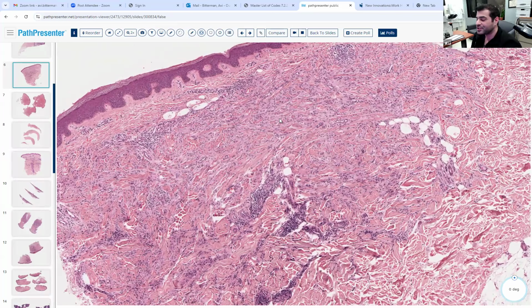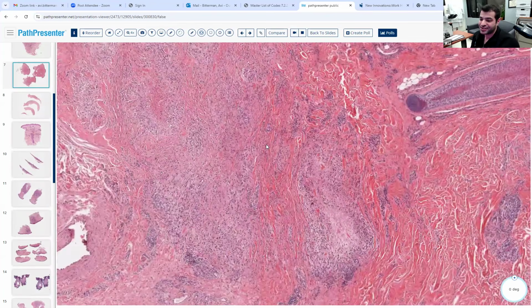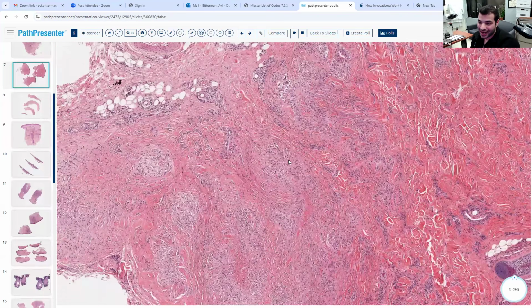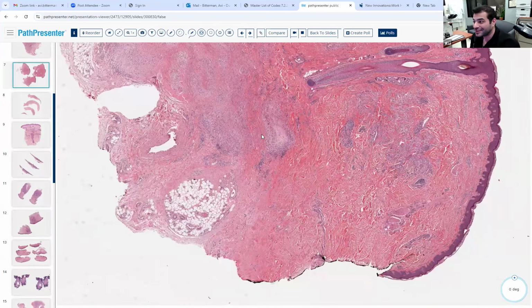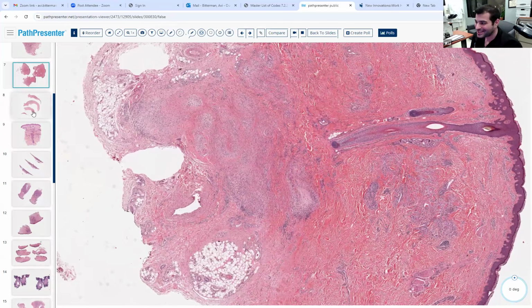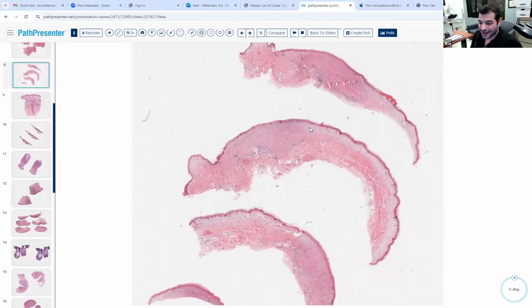Okay. So there's granulomatous infiltrates that are more diffuse and they're not granulomas. And this is one of them. This you can describe as a granulomatous infiltrate as well. This is not just this one discrete palisade. There's palisades here and here and here. So this is best described as a granulomatous dermatitis. Palisaded granulomatous dermatitis. Same page? Yes, thank you. Okay, very good.